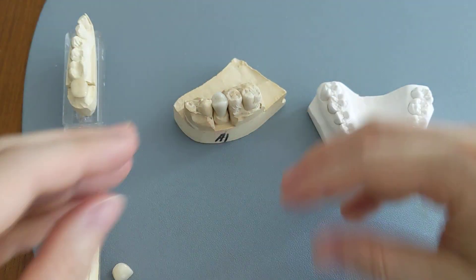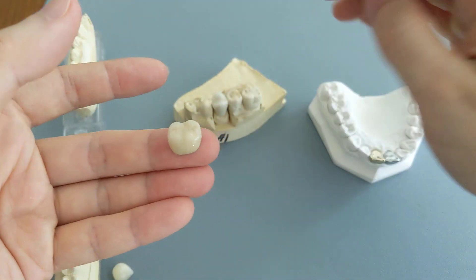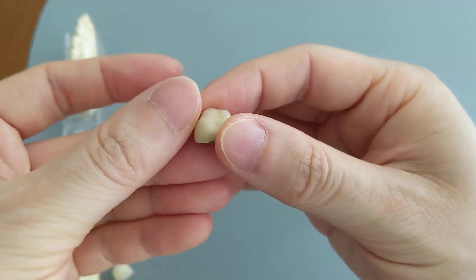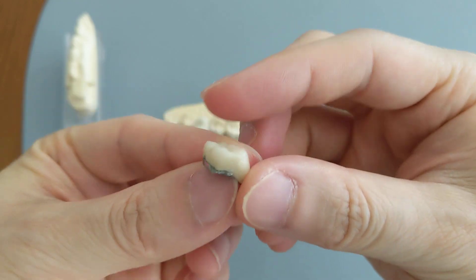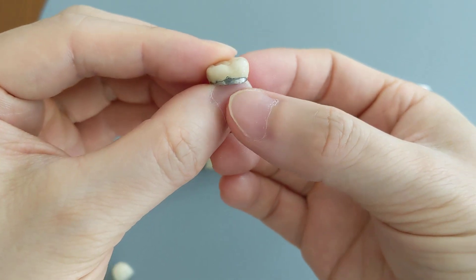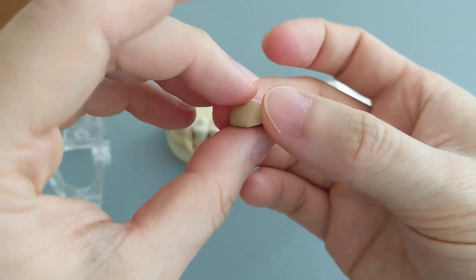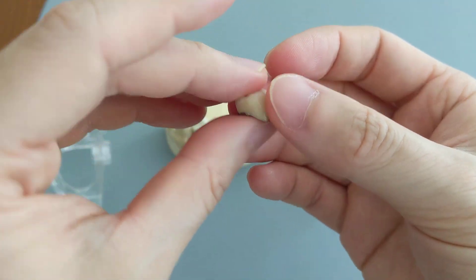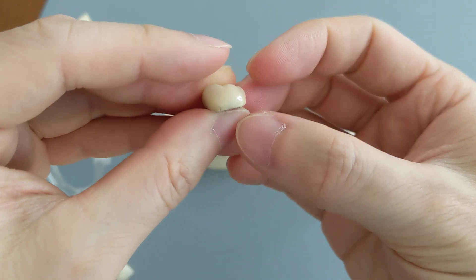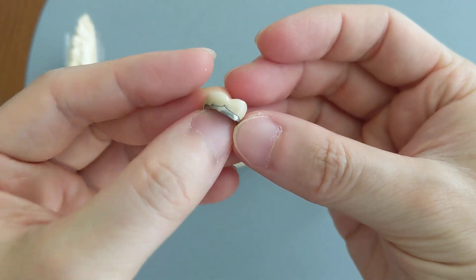We also have a molar PFM crown. As you can see, this one is a lot bigger than the premolar because molars are bigger than premolars. You can see the metal underneath, and on the edge here you can see some of the metal coming through. A lot of the reason why people don't like porcelain fused to metal ones is that the metal margins can show through — you can even see an entire band of metal on this side.